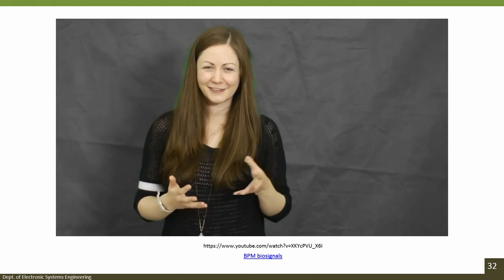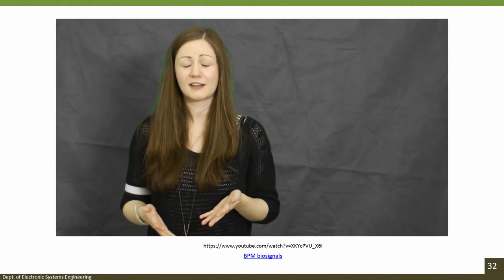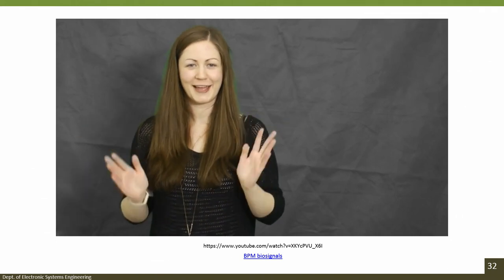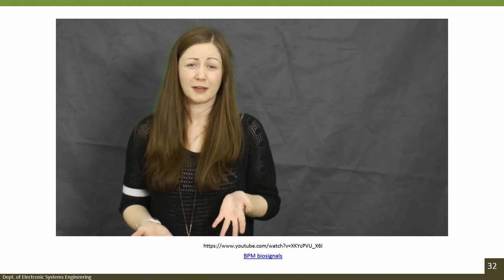So these devices are all quite interesting, quite exciting, but as we've seen in previous videos, it's actually quite difficult to measure a clean EEG signal without also measuring artifacts such as your eye blinks, your movements generally, or even your muscle activity in your face. All of it affects the signal. As you can't see, what these devices are actually measuring is a raw signal, and all you can see is the output, so the ears moving or the actual game. We're interested to see what they're actually measuring, because we found it difficult to do this before.